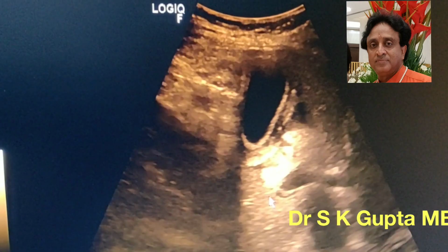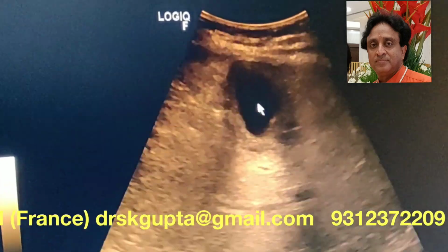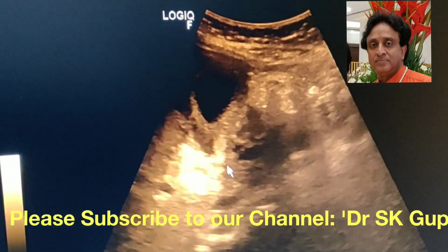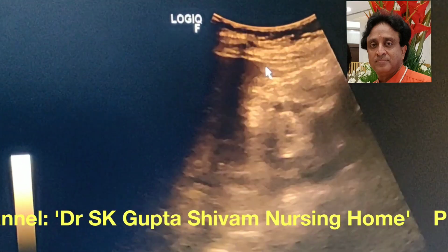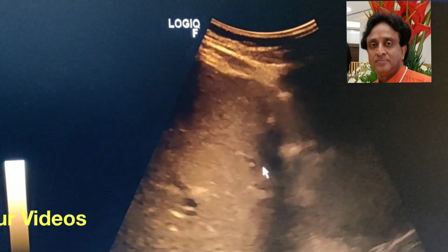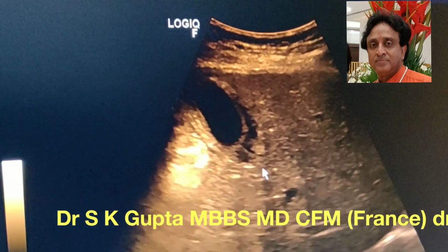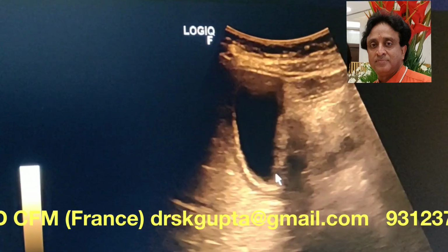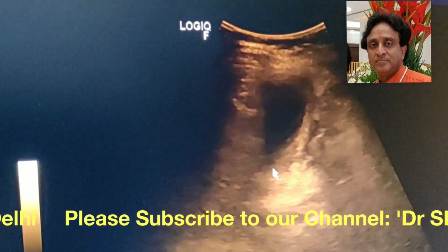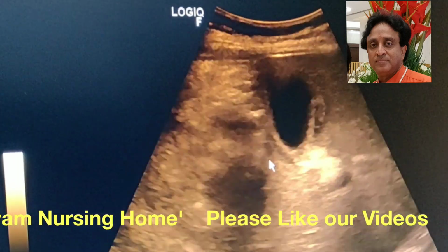You can see that the liver is enlarged, and the gallbladder wall shows marked edema. And there is fluid around in the gallbladder fossa, and this is suggestive of hepatitis, and the fluid around the gallbladder fossa is a hallmark of dengue hemorrhagic fever. When the fluid leak starts from the vessels and starts accumulating in the serous cavities, there can be fluid in the peritoneum called ascites, or there can be fluid in the pleural cavities called pleural effusion, or there can be at times fluid in the pericardial cavity also.